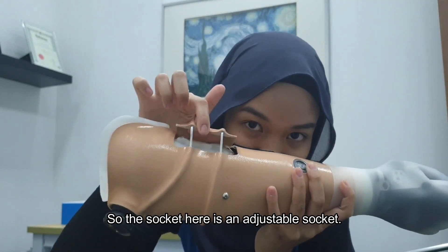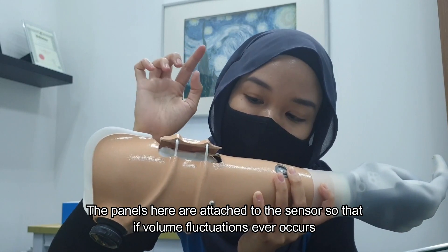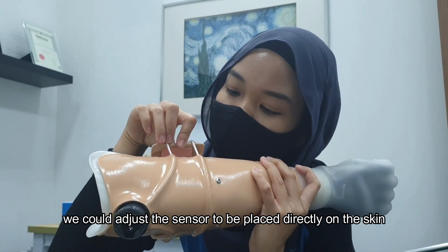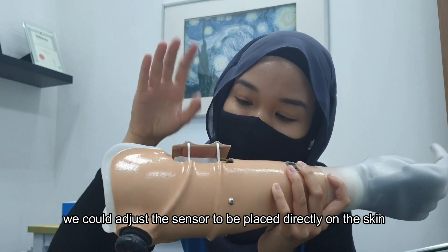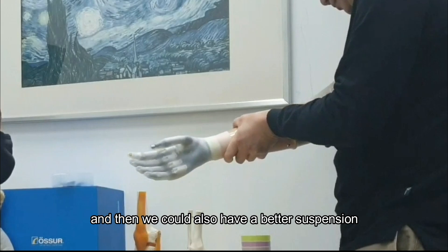So the socket here is an adjustable socket. The panels here are attached to the sensors so that if volume fluctuation ever occurs, we could adjust the sensor to be placed directly on the skin, and then we can also have a better suspension.